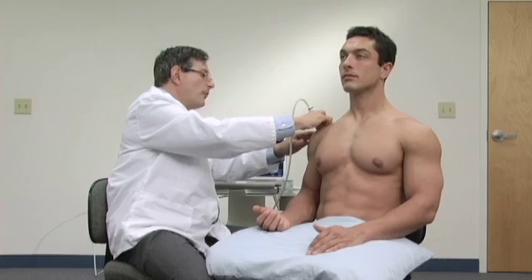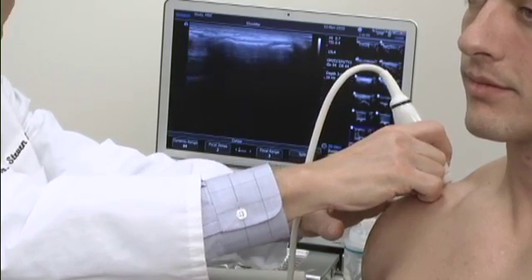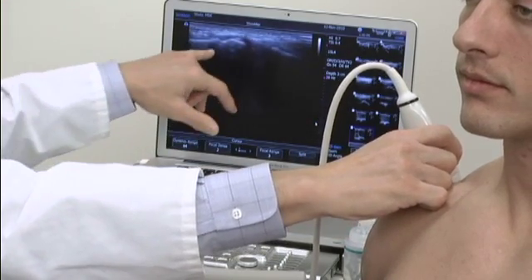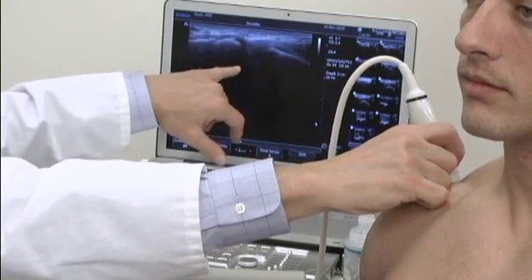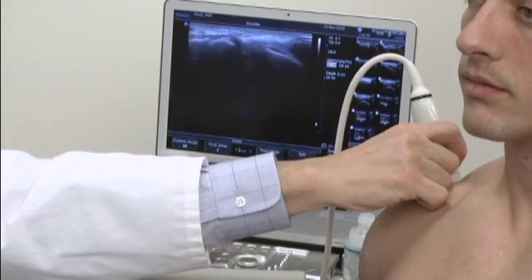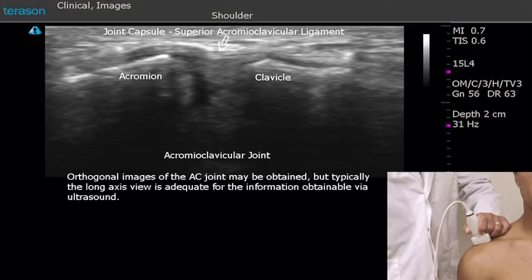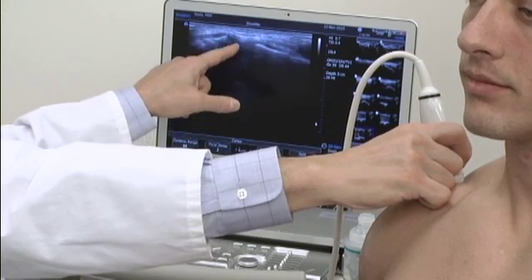The other way of finding this is simply to palpate the joint. Here we can actually see — screen left is the acromion, screen right is the clavicle, and this represents the acromioclavicular joint. I'm going to give a little bit of gain to make it a little easier to see. This again is the clavicle, this is the acromion, this represents the acromioclavicular joint, and the capsule of the joint is here, and the internal meniscus of the joint is this bright area in through here.